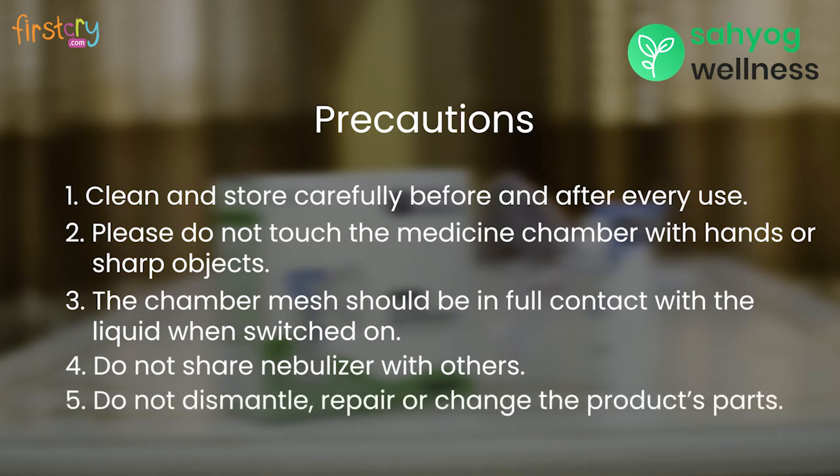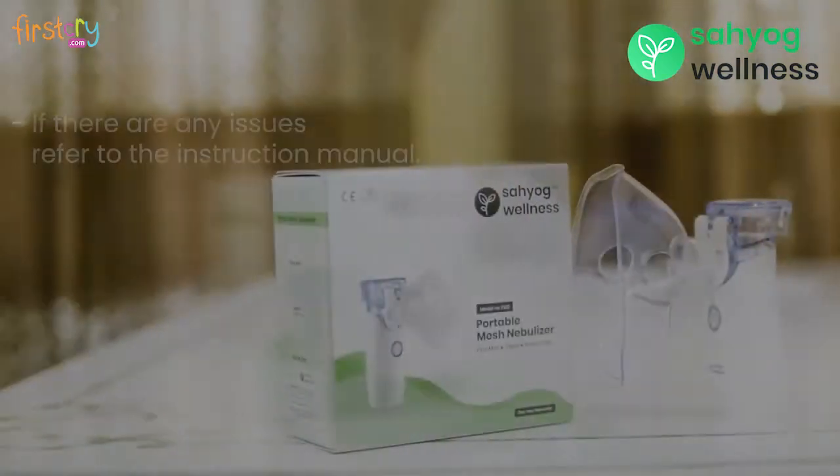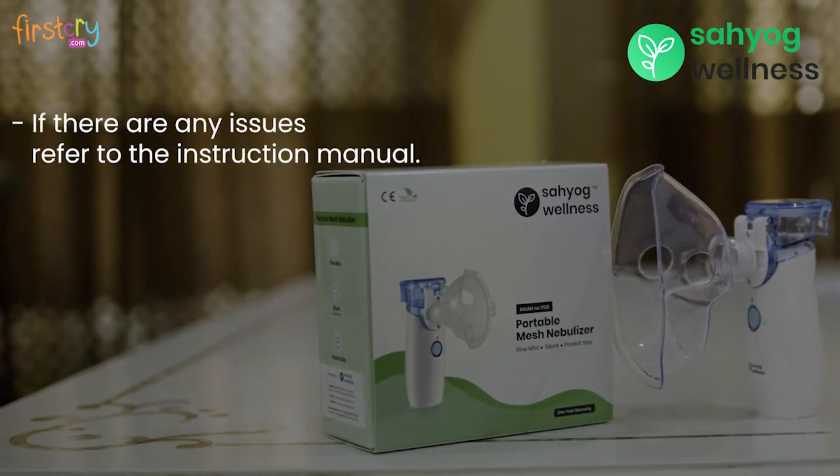It is strictly prohibited to dismantle, repair, or change the product parts. If there are any issues while operating the portable nebulizer, please follow your instruction manual to solve it.